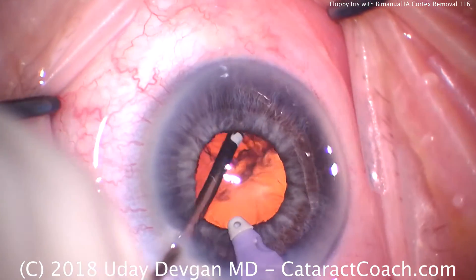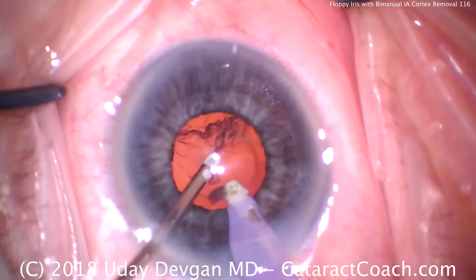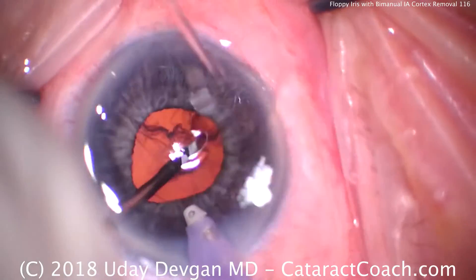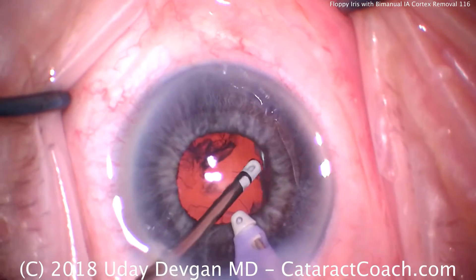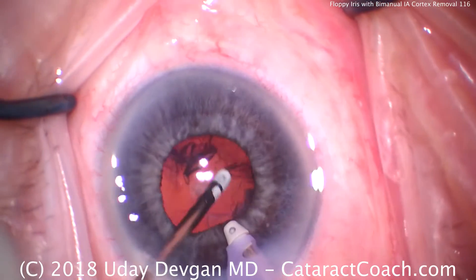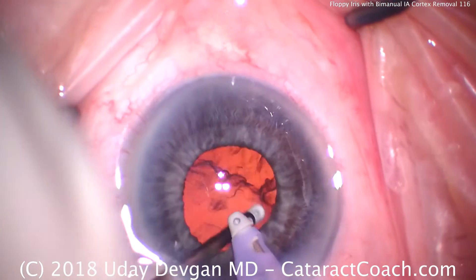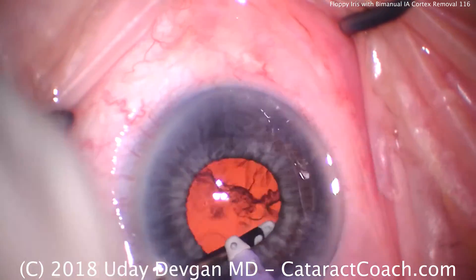This is not a speed show — this is not going to be one of the fast cataracts; this one's going to be about eight, nine minutes. Taking our time, we're trying to get an edge so we can grab it and pull all that cortex forwards. The right hand is just infusing fluid into the eye; the left hand is doing all the aspirating. Finally getting a hold on this — we can see it's going to be a big shell. My goal now is to loosen up that entire shell so it'll come up in one piece. We've removed most of it and then rotating around.